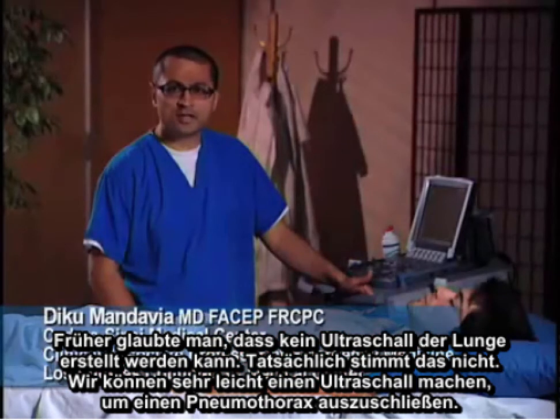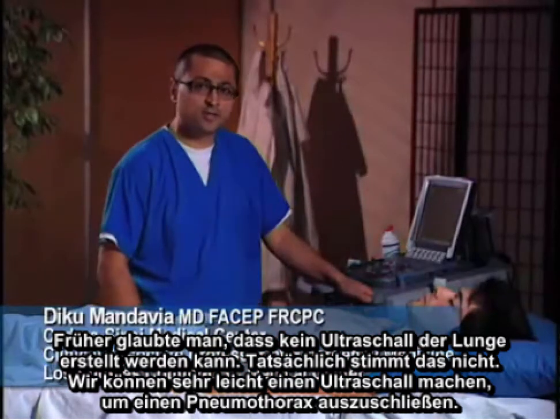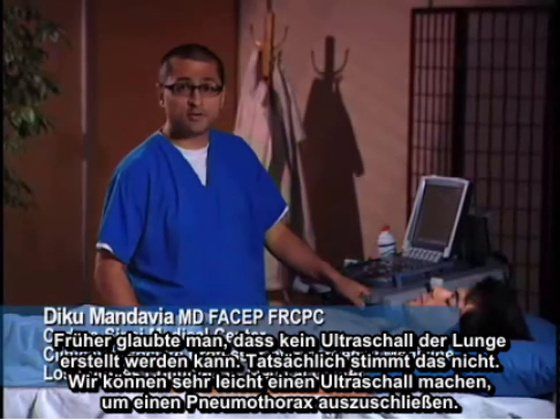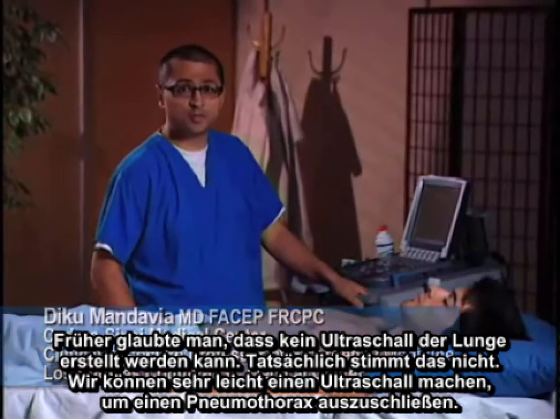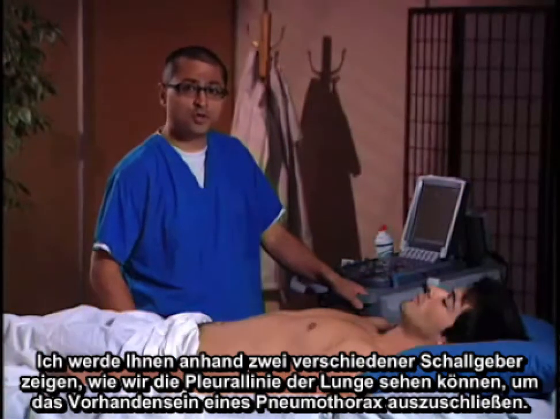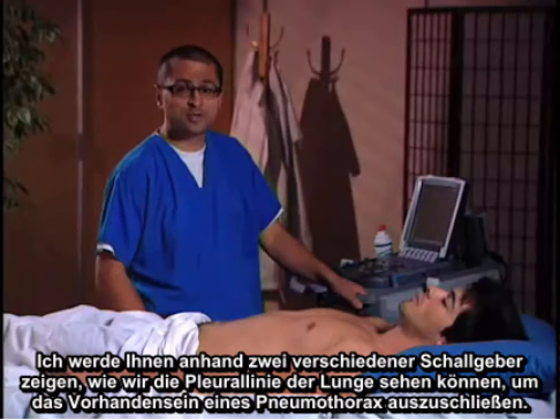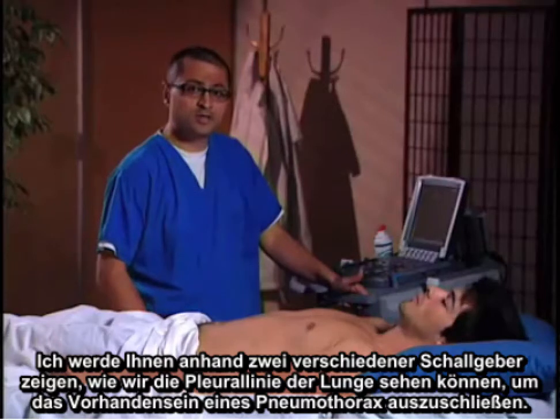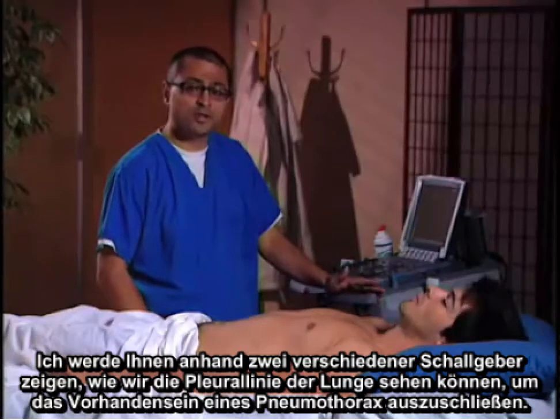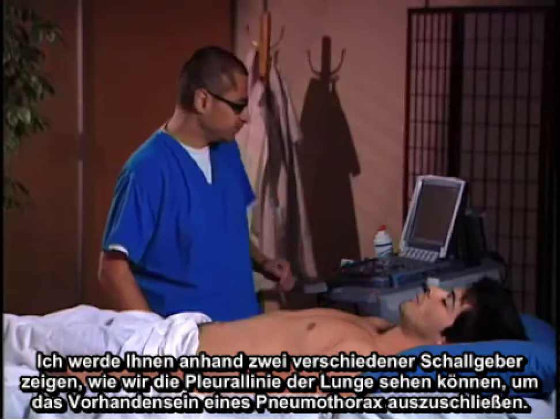Classically, it's been thought that the lung cannot be ultrasounded. In fact, that's not true. We can use ultrasound very easily to rule out a pneumothorax. I'm going to show you, using two different transducers, how we can see the lung pleural line to exclude the presence of a pneumothorax.